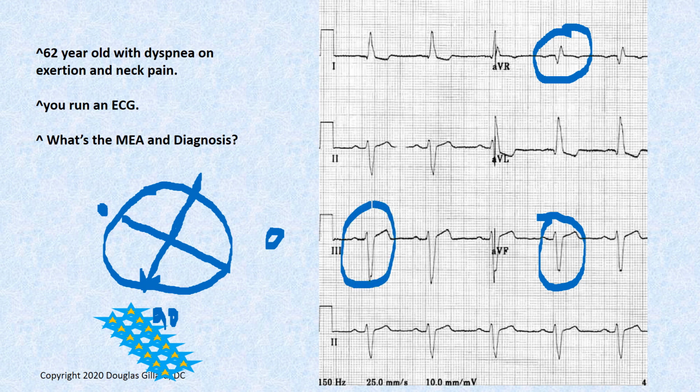No way. It's wickedly negative. So the current is not going that way. It must be going this way. Who's over here? AVL's over here. So AVL should be positive, right, because the current is semi-heading at it. Is that true? Yeah. In fact, it looks like it's heading right at it.